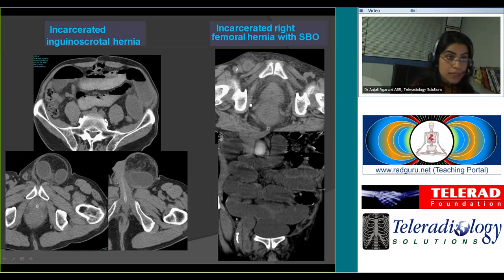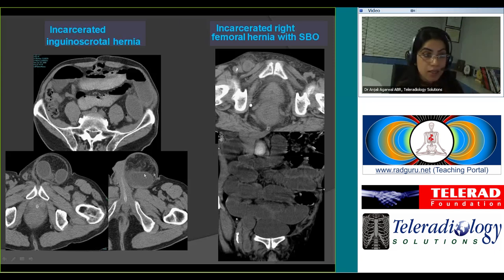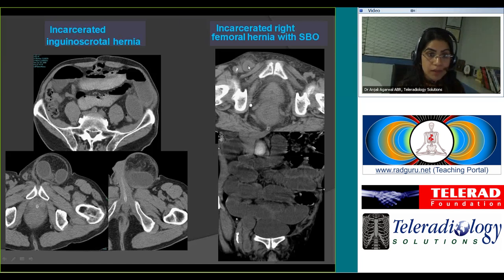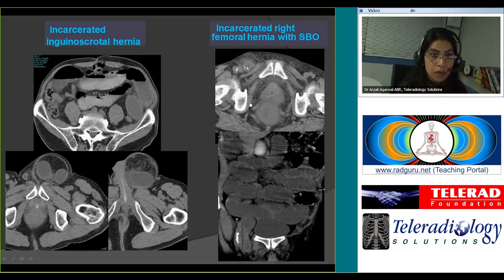Hernias are also a common cause of bowel obstruction. This patient had an inguinoscrotal hernia containing dilated fluid-filled bowel loops with proximal loops also dilated — a case of incarcerated hernia with small bowel obstruction. Another patient had an incarcerated femoral hernia with small bowel obstruction. Note the difference in location: inguinal hernia is quite medial, away from the femoral vessels with no compression of the femoral vein; in a femoral hernia there is compression of the femoral vein, which is fairly useful in making the diagnosis.